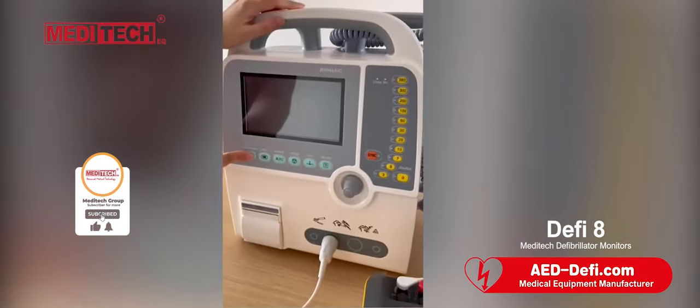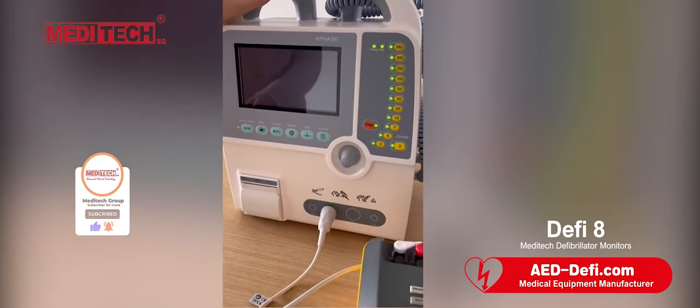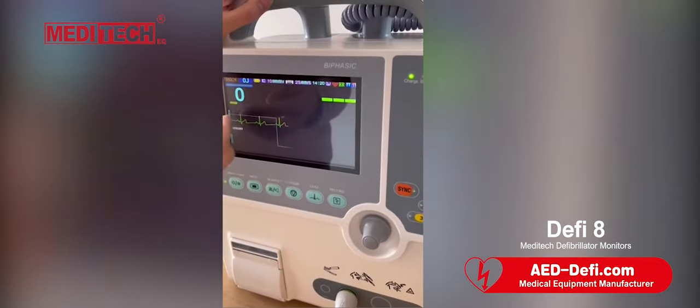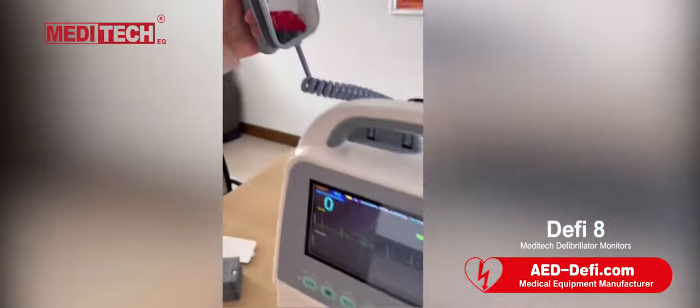Touch and hold this key. You can see this waveform via ECG cable, and this waveform via pad or pads.